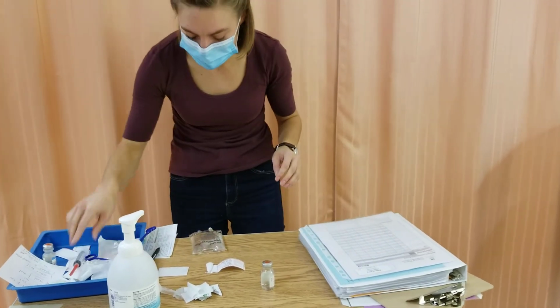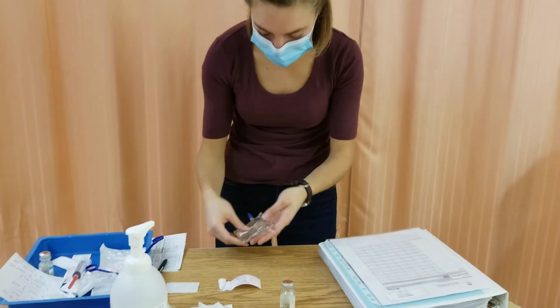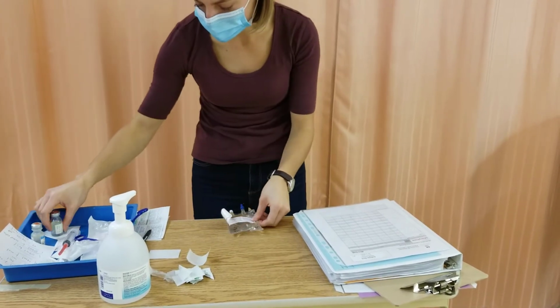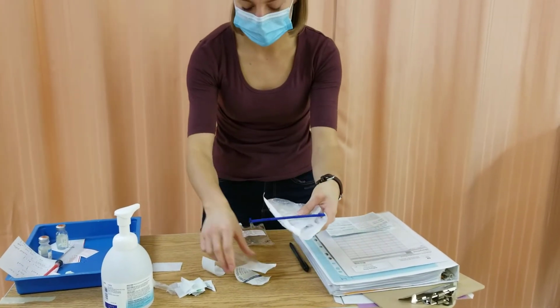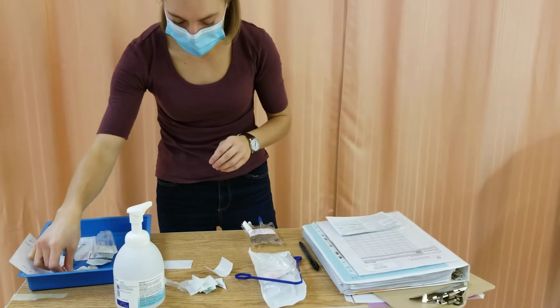That gets it started into the med waste. Gently rolling this around to mix it. And then putting on my label. I'm ready to go to the bedside now. I've got my MAR and drug card and medication. Got my secondary tubing that I labeled with the date and time and my initials. And an alcohol swab.